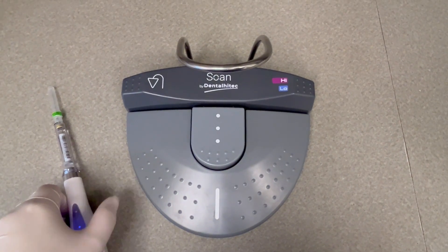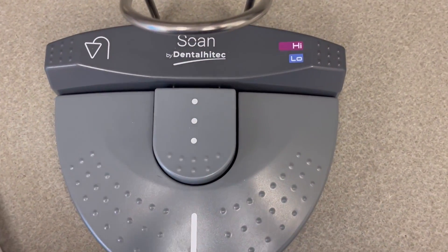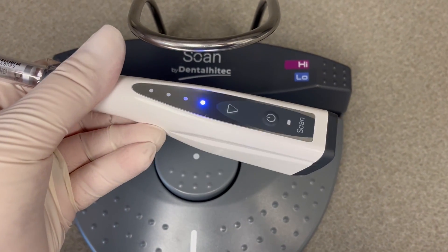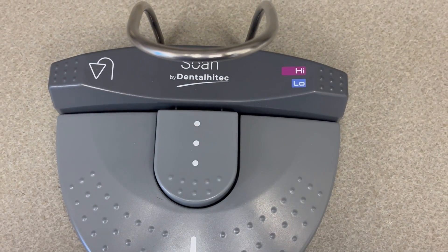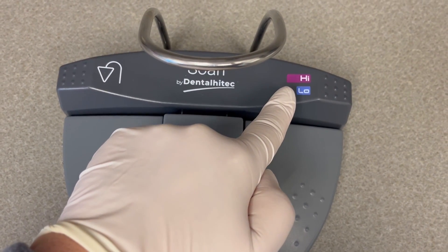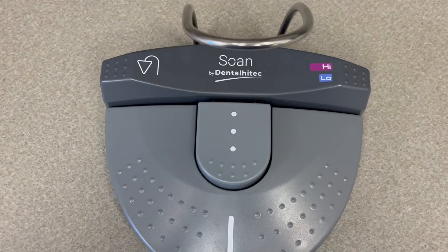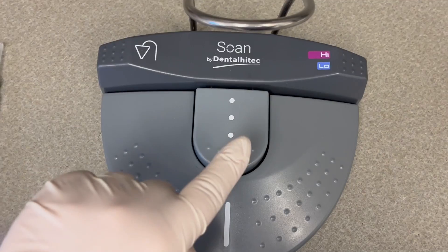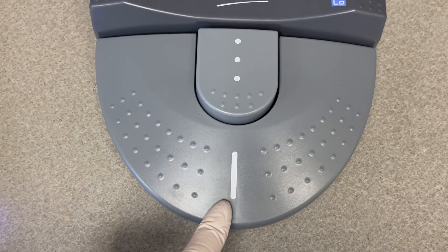This is the foot pedal you'll use to administer local anesthetic with your device. Depending upon the patient and what type of injection you're going to give, there are three speeds to choose from. For pediatric intraosseous, I have it preset on low, which is indicated by the blue light on the handpiece. For an adult conventional injection, you could switch to high. If you needed to aspirate, you could press here to return and aspirate. Drop by drop is for when I'm numbing the papilla or the mucosa.